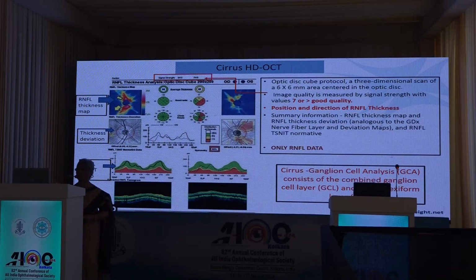That's of good quality. Now I'm trying to show you with the cursor, is my cursor working? No. I wish I had a bit of... it's working? Okay.